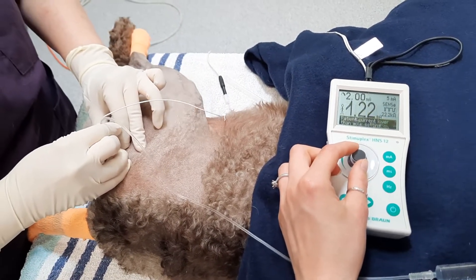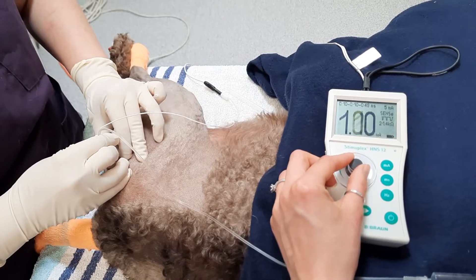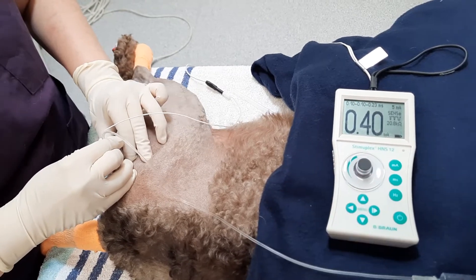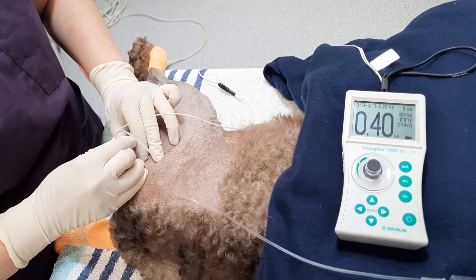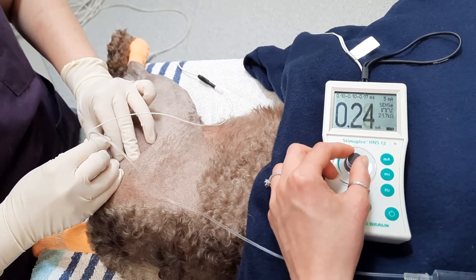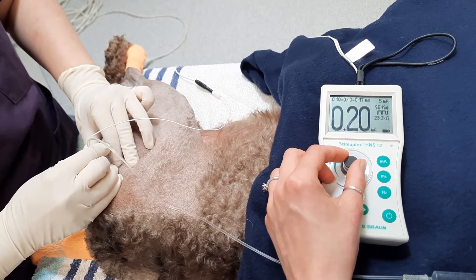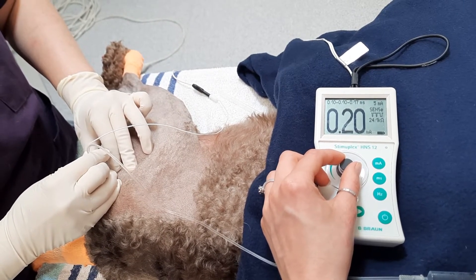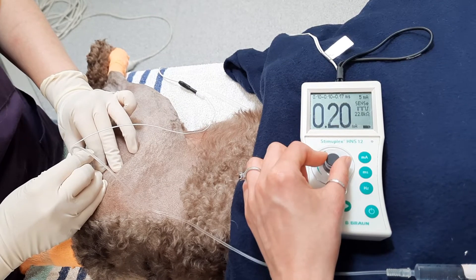This is the kind of stimulation that we want to see, and then we'll slowly decrease the stimulation to 0.4. At 0.4 there should still be nerve stimulation — it shows that we are close to the nerve. Next we'll decrease the stimulation to 0.2 just to check that we're not within the nerve. If at 0.2 we're seeing some kicking or stimulation, it means that we're in the nerve. It stopped kicking, so we're not in the nerve. To double check that we're still close enough to the nerve, we'll increase that to 0.4 and we're seeing some stimulation, so that's good.